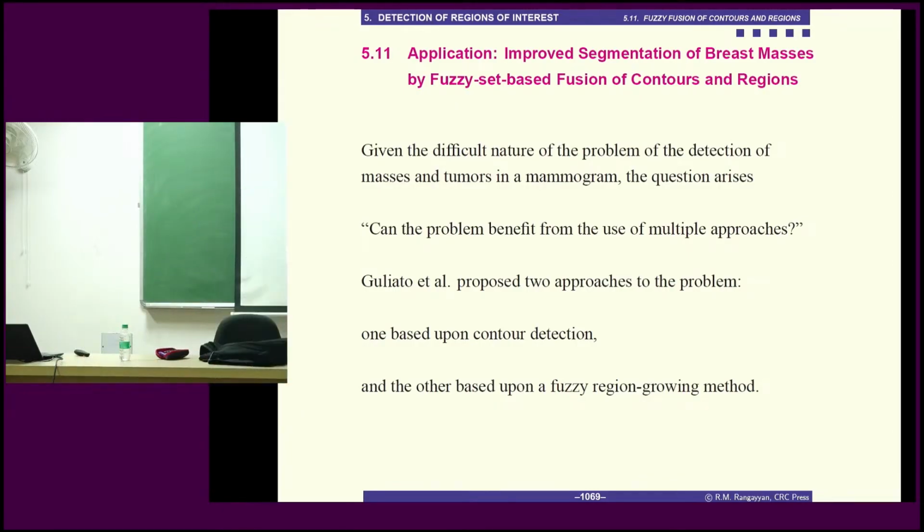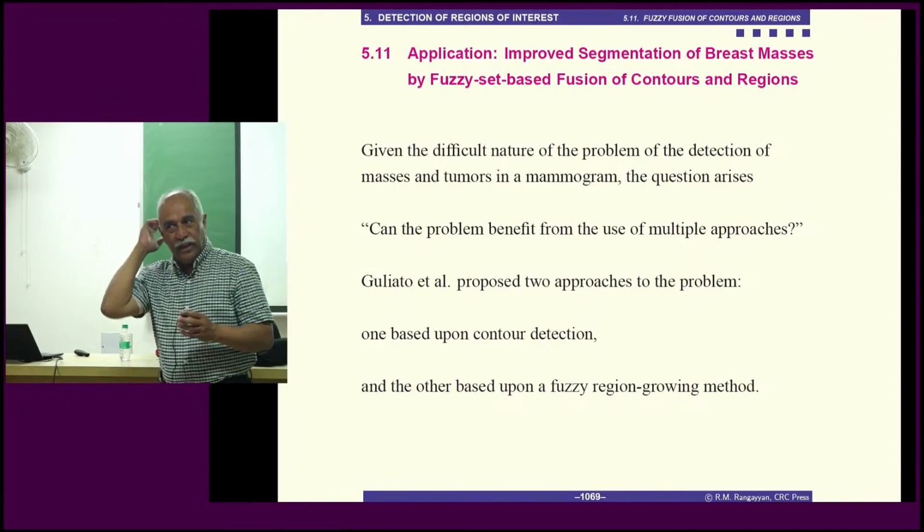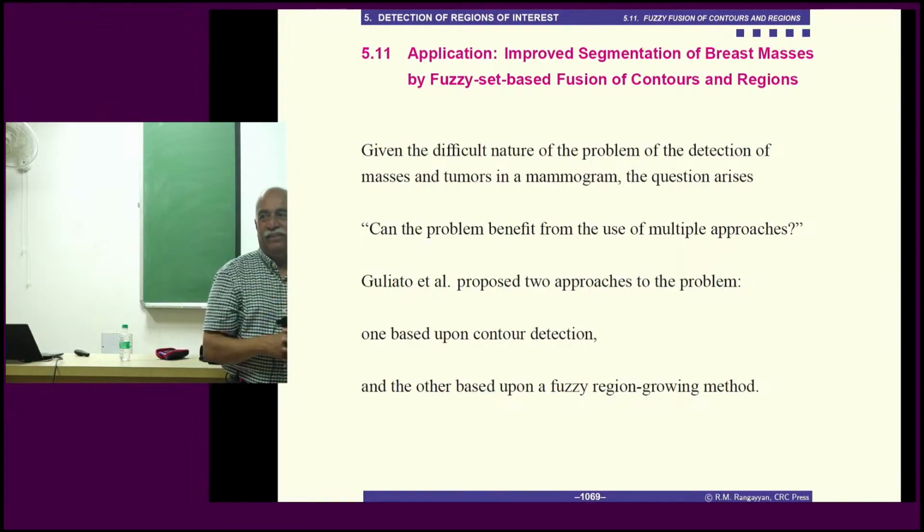The advantage with the Gabor might be like multi-scale and multi-orientation. Correct. But scale is not important here. It's only the edge you want. So there is no scale in the edge. But wavelets were a topic of interest at that time. Gabor filters in multi-scale formulation were a topic of interest, so it was used. But perhaps it could be simplified further. You don't need all of that information. But it worked, so it's there.